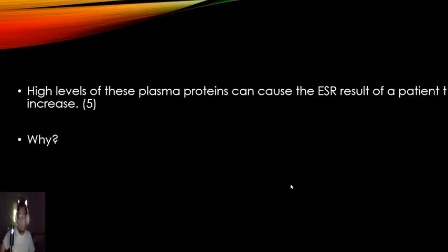All right, so pronunciation is fine as well. It's actually Rouleau formation. Thank you so much. This is known as RBC stacking or stacking of coins. If you see this word Rouleau, it means that basically the cells are just stacking. Very good, Alfonso. This is the correct spelling.